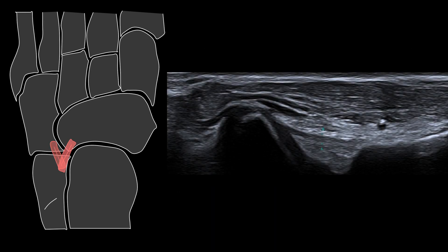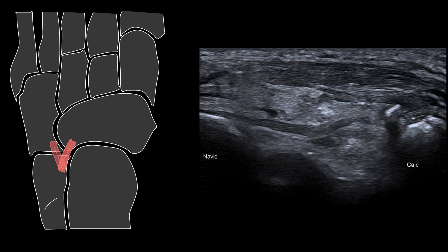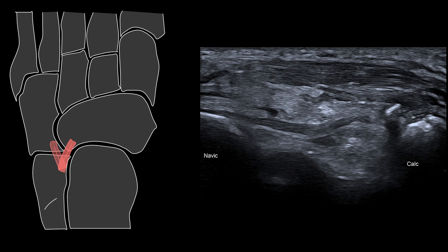To get the calcaneo navicular component, we simply anchor one end of the probe on the anterior tubercle of the calcaneus and rotate the probe until we identify the navicular. The lateral tarsal artery can be used as a landmark to help identify the medial limb of the bifurcate ligament.